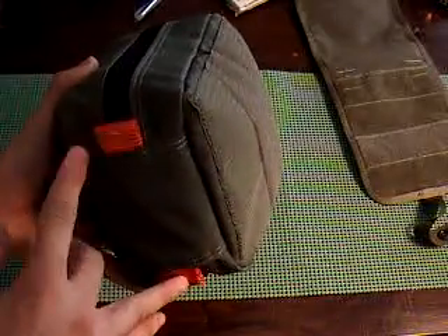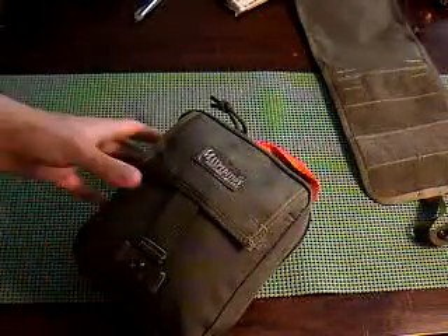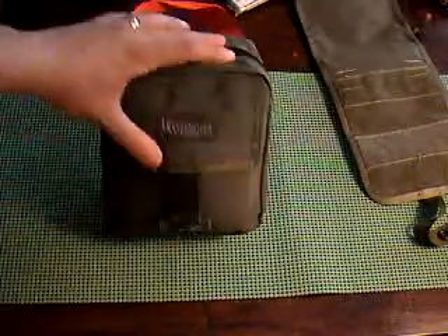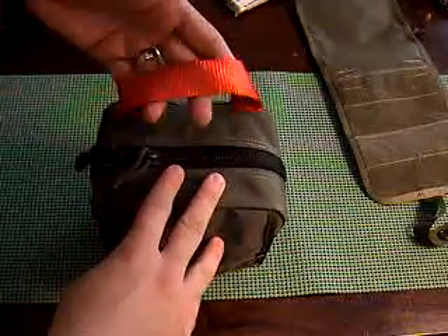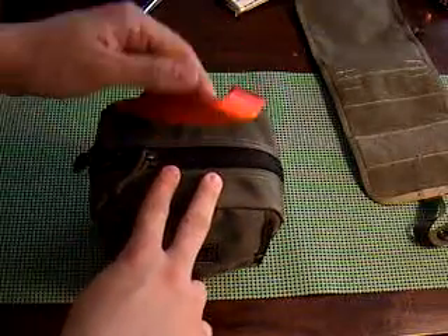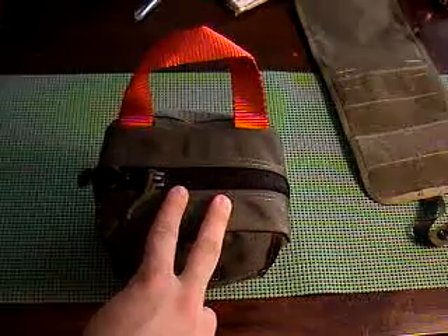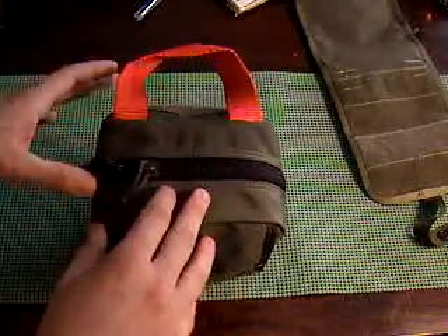There are two red loops here — it's identified as a medical pouch. I think the reason they're on the bottom is so that somebody can identify it as a medical pouch, but it's not all over the top, which would give it away as a medical pouch when you're out with the military and camouflaged — a red strap can give you away. So I think that's why they did that.